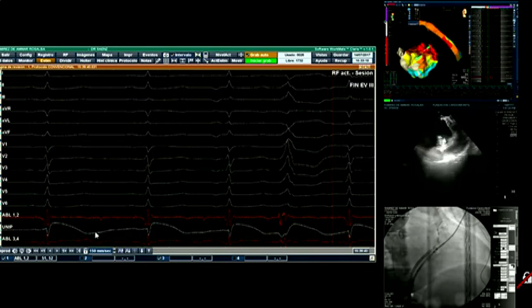And what you were saying, that we were going to be better in the endocardium, the pacing of the endocardium was earlier. I believe that if the endocardium pacing would have been later than the coronary sinus, we should have found a way to ablate it closer to the coronary sinus. But here I was reassured because I know that it wasn't the right side. With this 2 centimeter distance, we would have been successful from the endocardium.